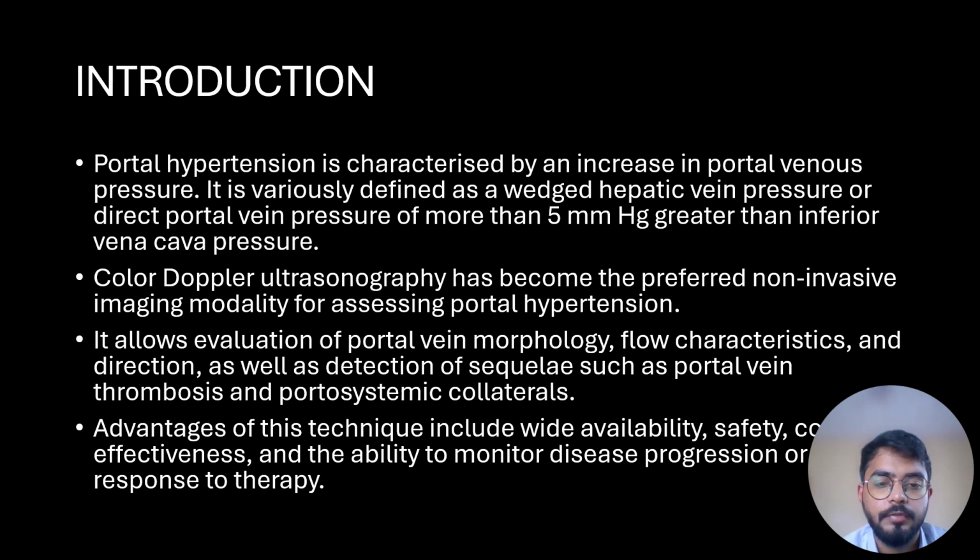Color Doppler ultrasonography has become the preferred non-invasive imaging modality for assessing portal hypertension. It allows evaluation of portal vein morphology, flow characteristics, and direction, as well as detection of sequelae such as portal vein thrombosis and portosystemic collaterals. Advantages of this technique include wide availability, safety, cost effectiveness, and the ability to monitor disease progression or response to therapy.